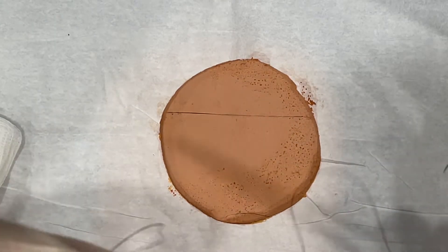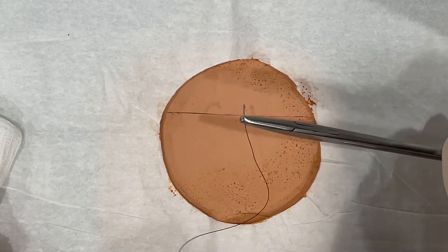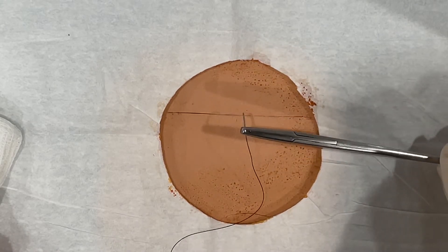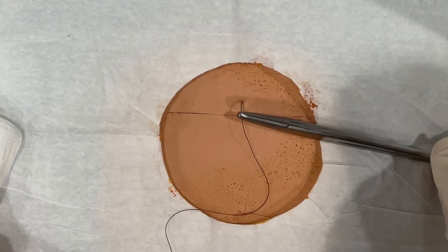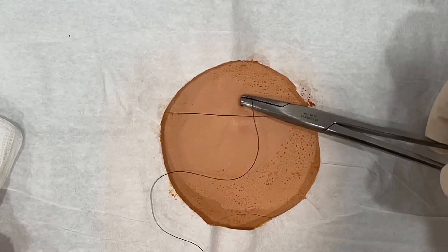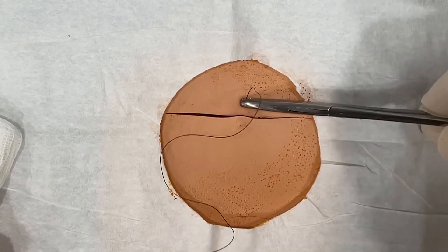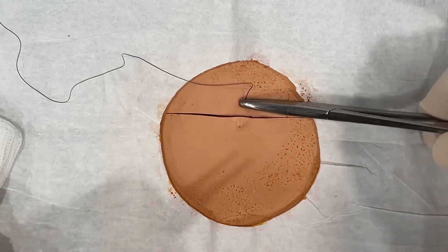Hold the excess in your left hand if you're right-handed. Go in midway through, perpendicular to the skin.